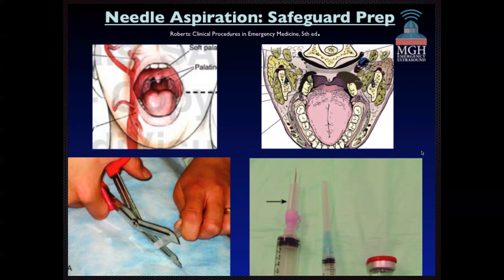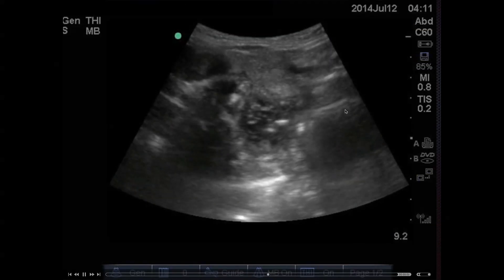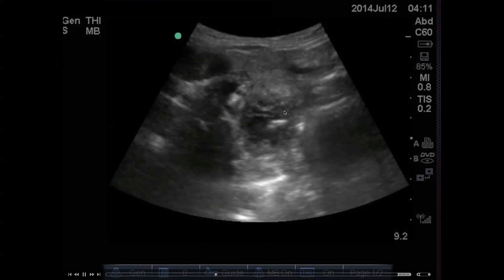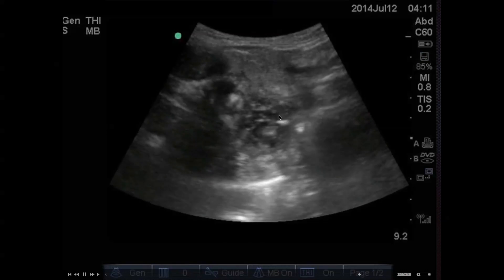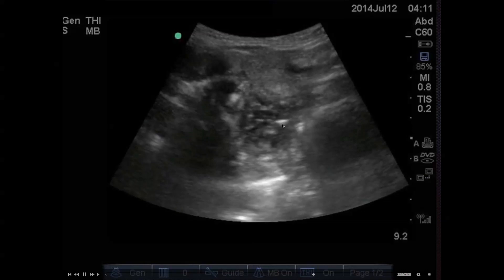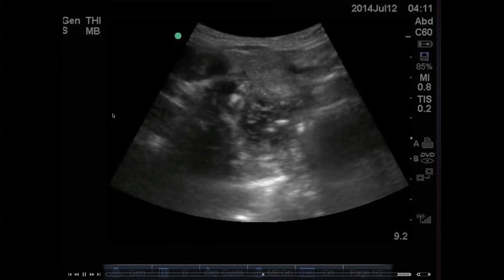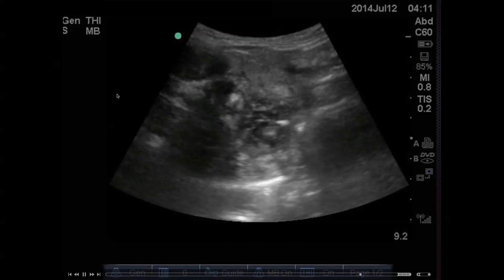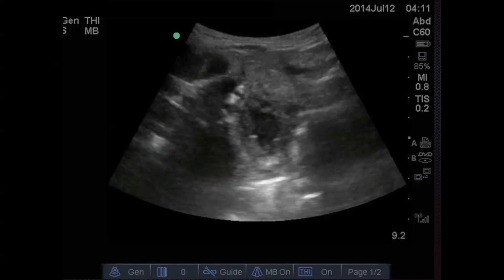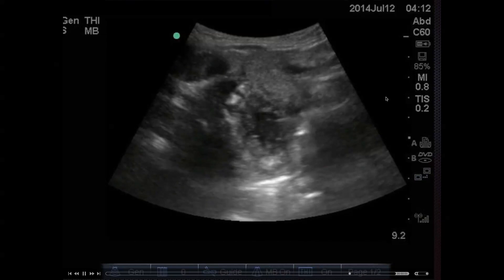We put a cap on for about two centimeters. Then he anesthetized — he put the needle in and went a little deeper than I thought. I was hoping he would just get the anesthetic right in the actual tissue. But watch it again: you can see as he's injecting the lidocaine, the fluid cavity is filling up with that lidocaine. So we knew he was in the right spot. He then withdrew the needle and I said, put the big needle exactly where you anesthetized it, where the patient has that little drop of blood.